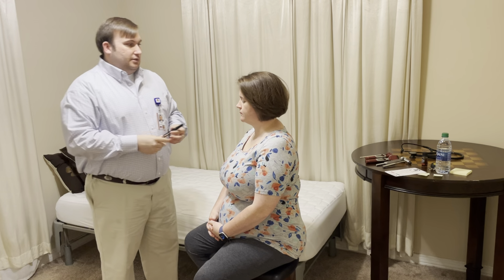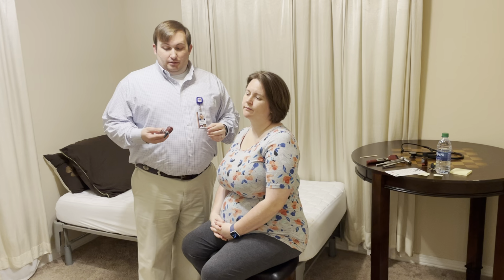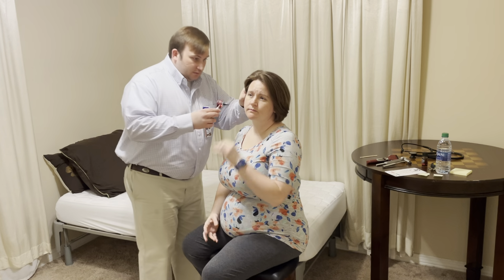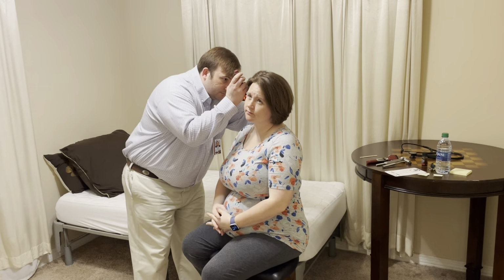Now, I'm going to look at the ear. I'm going to palpate. All right. Does that hurt? Pain is absent. I'll then go ahead and perform with the otoscope. I'm going to be looking for any kind of foreign objects. I'm going to be looking at the tympanic membrane to make sure that the canal is patent. All right, canal is patent, no foreign objects noticed. I did see the tympanic membrane, which is pearly and gray. There was a cone of light, and part of the malleus bone was visualized.